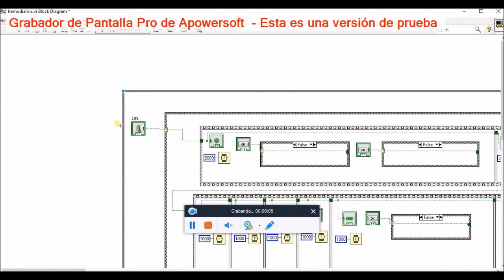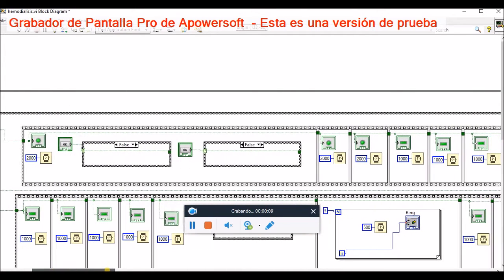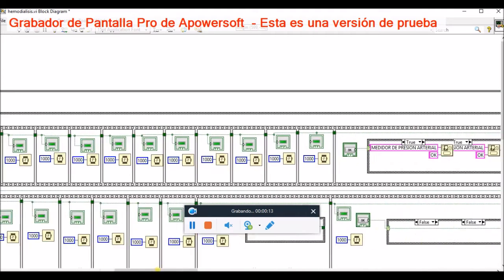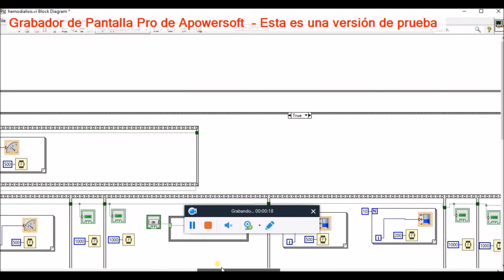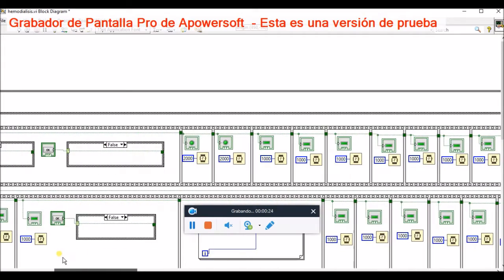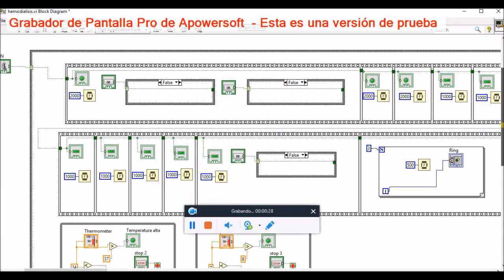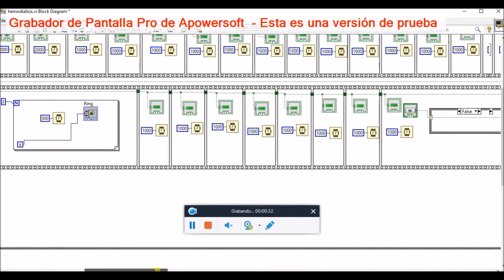Once the machine has started, blood will flow from the arterial catheter limb through the port that allows for blood sampling and medication administration to the roller pump. A pre-membrane pressure sensor is located before the blood enters the filter. The blood then enters the filter where clearance and ultrafiltration occur.